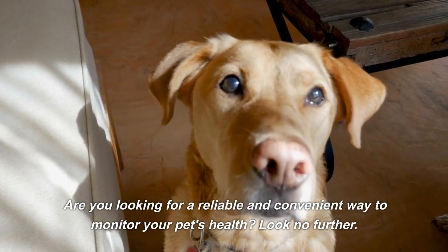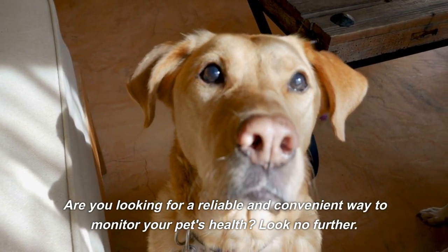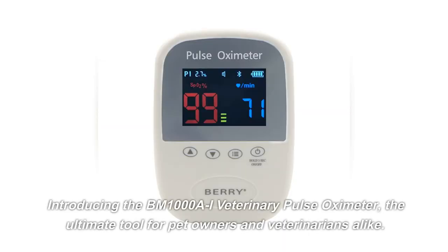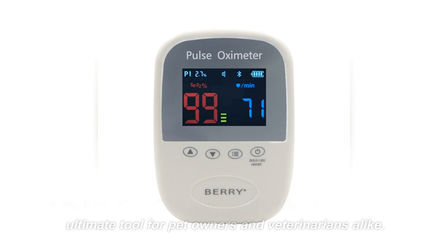Are you looking for a reliable and convenient way to monitor your pet's health? Look no further. Introducing the BM1000AI Veterinary Pulse Oximeter, the ultimate tool for pet owners and veterinarians alike.